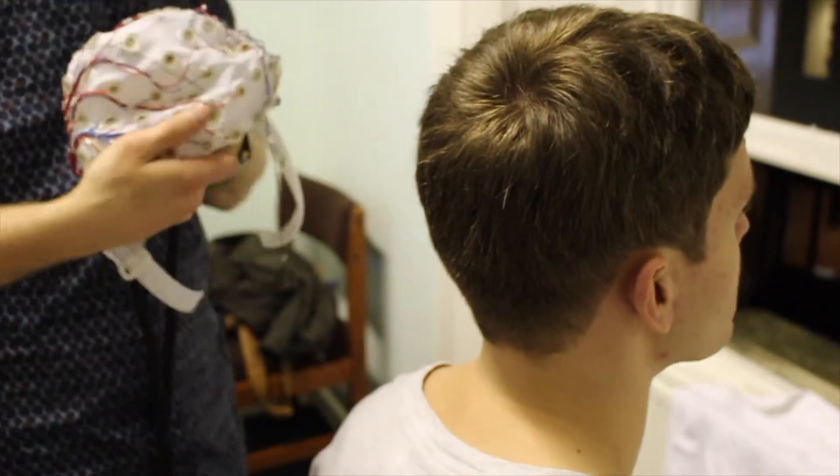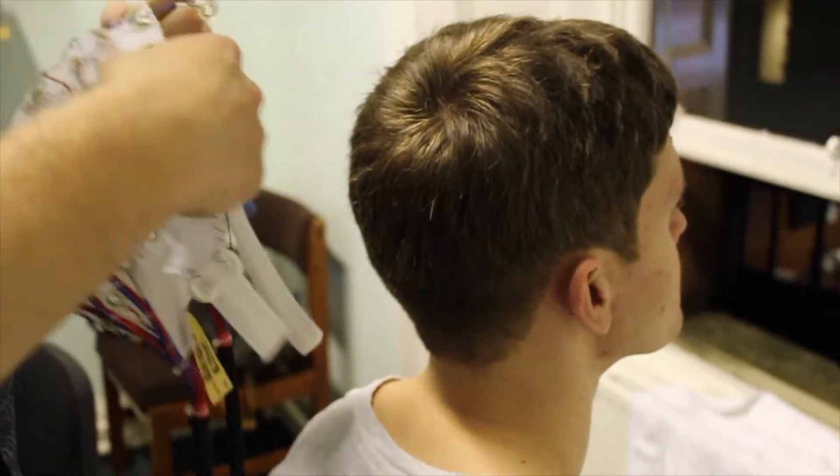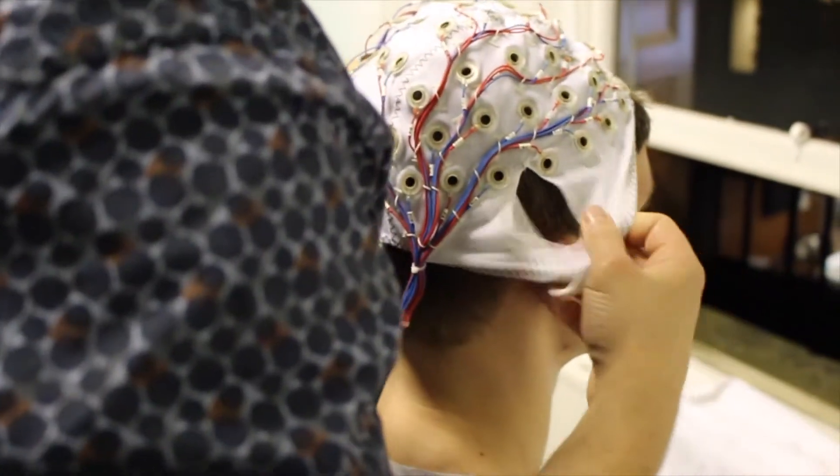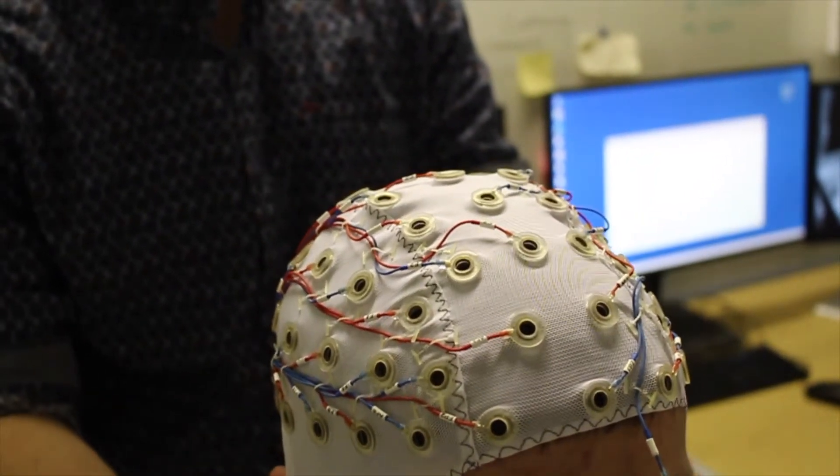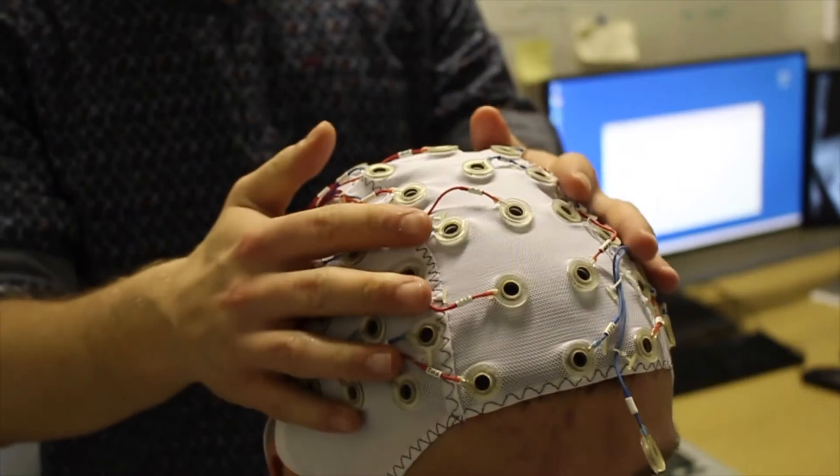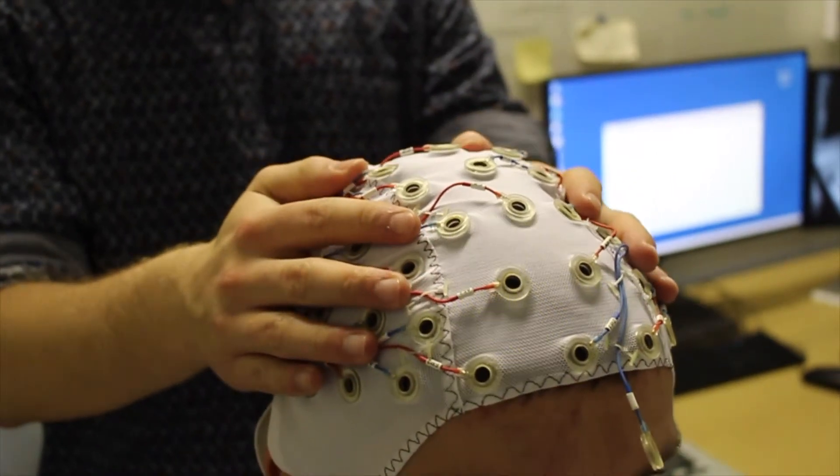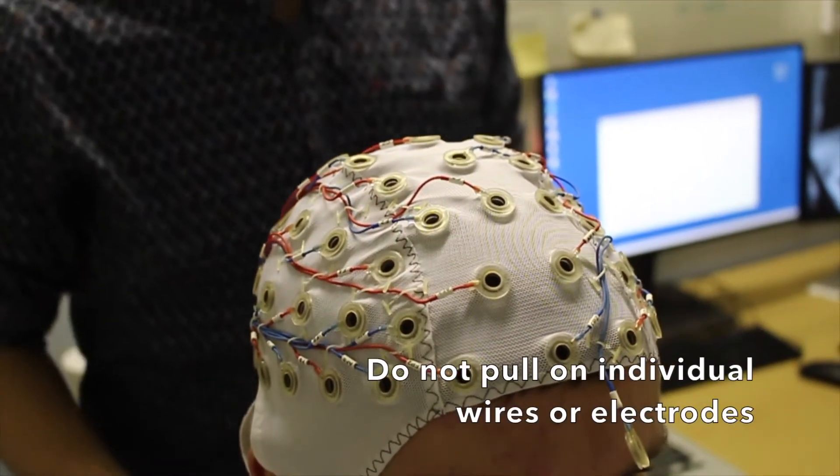The cap goes on a bit like a swimming cap, so you should stand either in front of the participant or behind them, and lower the cap onto their head. Try and keep the electrodes lined up straight along the head while you do this.